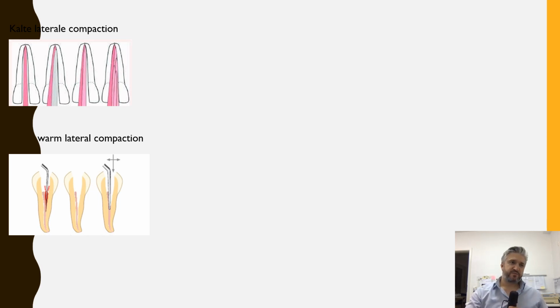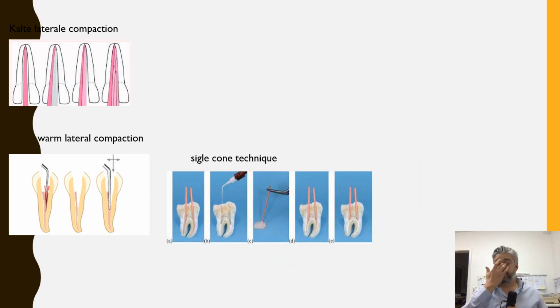There may be some people who like this technique. I don't like it personally. Then we have the single cone technique. This is very quick, very effective.